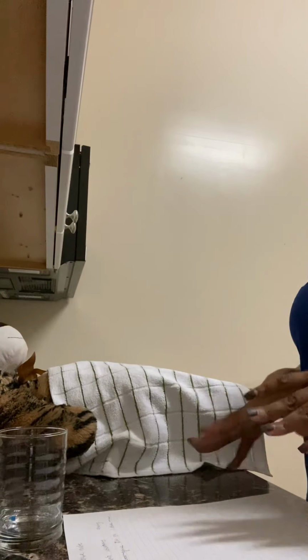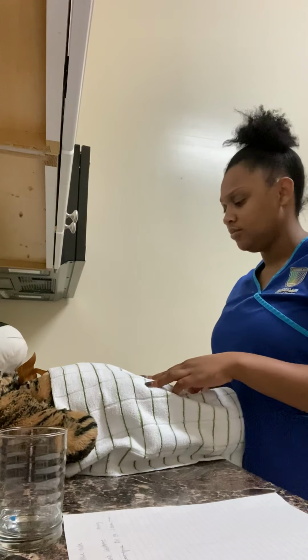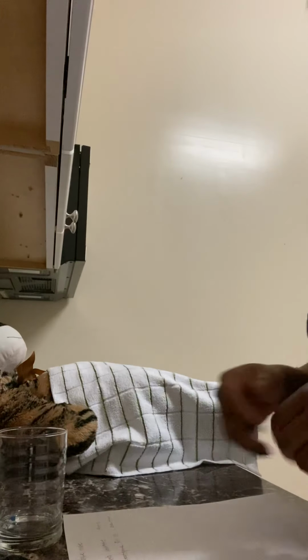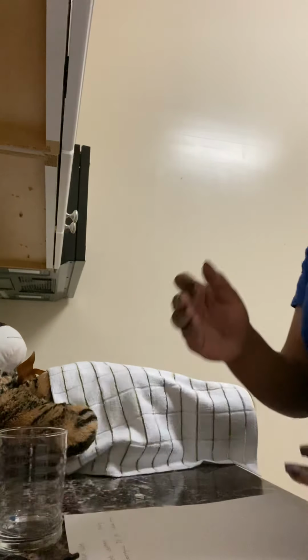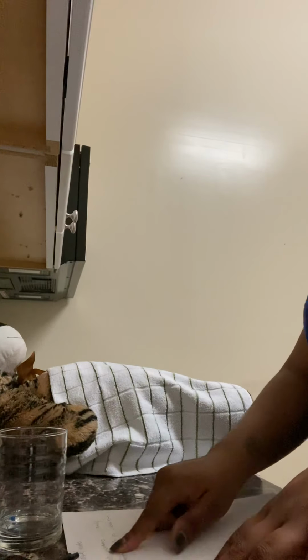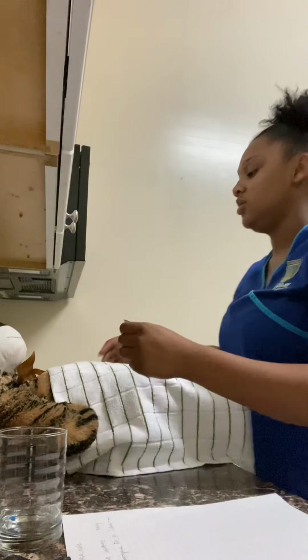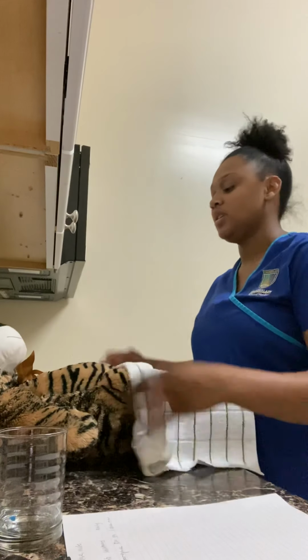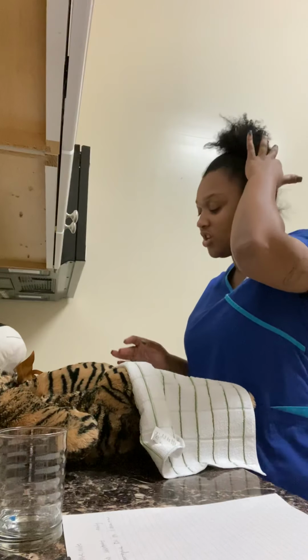Sounds good. Mr. Teddy, would you prefer to have your insulin or your Tylenol first? Insulin? Gotcha. The patient has requested that we give the insulin. I'm just going to double check that I have my insulin here in my bedside sterile environment. I'm going to once again look at my MAR to see what I'm administering to the patient. Okay, Mr. Teddy, we're going to just move your clothes down. Inspect the area. There's no signs of any wounds, rashes, swelling or redness at the injection site.